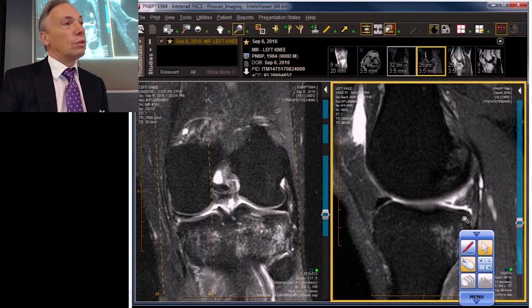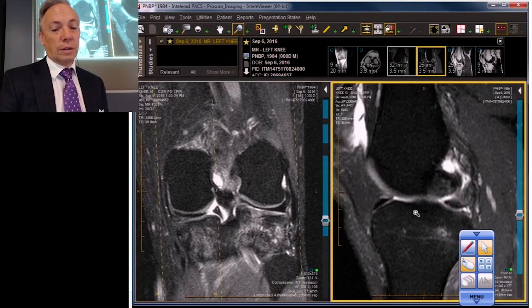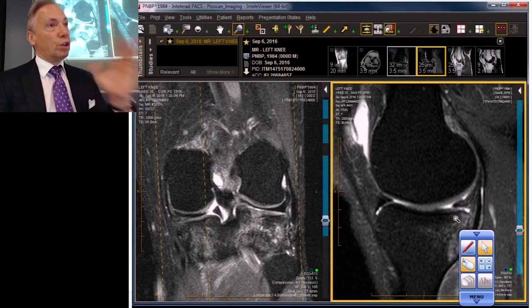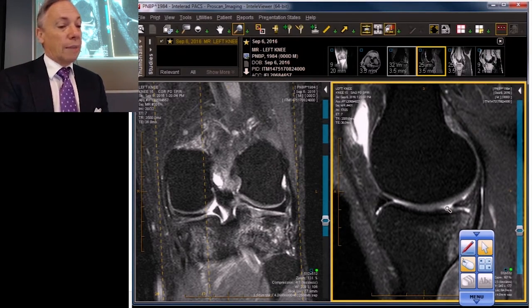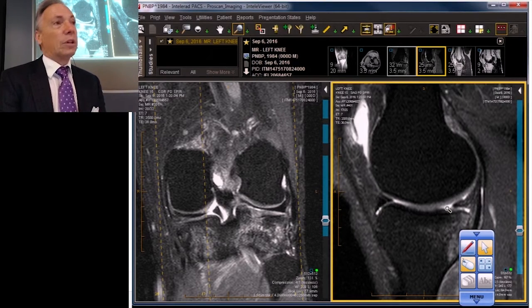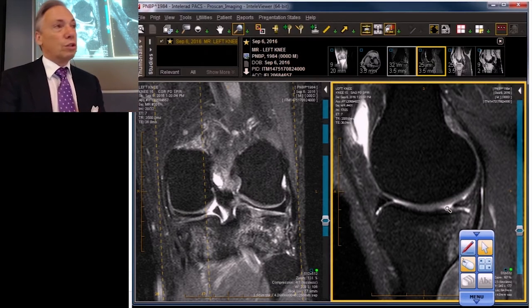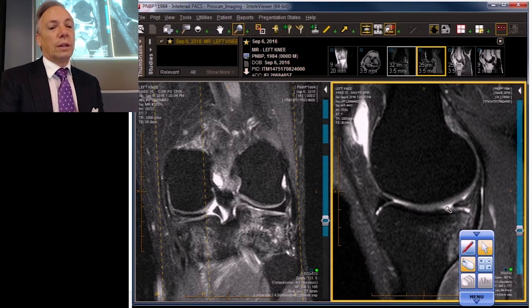I also wanted to show you the meniscal ghost. Here we are, right through our radial tear — the meniscus is there... it's gone... it's back again. So you're missing that chopped segment right there. Meniscal ghosting, or loss of meniscal signal, can be seen with congenital absence of the meniscus, which is much more common laterally, although still a rare phenomenon. You can also see it with autodigestion from rheumatoid arthritis, a big bucket handle tear that separates the meniscus into two pieces, a giant radial tear, or even infiltrative processes like CPPD and gout, which may completely wipe out and obliterate the meniscus.